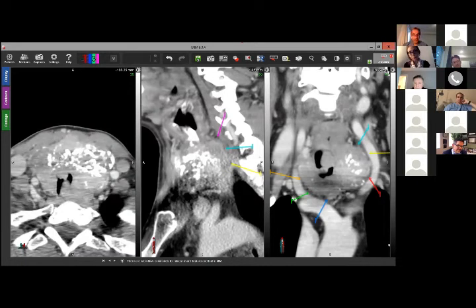So this feature already makes it high risk for anaplastic thyroid carcinoma, but this amount of calcification would not be typical for it. On the other hand, we don't see that very often. We do not know what it means, but in terms of the case classification image description, this is a partially calcified large mass encasing the trachea, going through the trachea, inseparable from the esophagus.